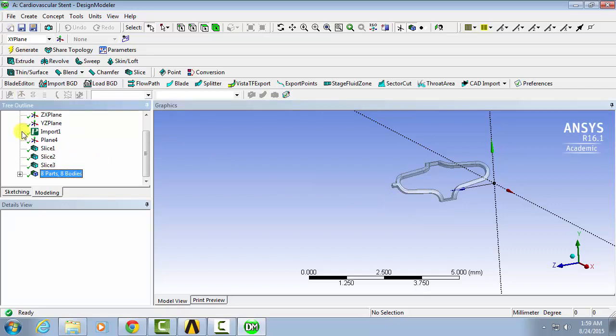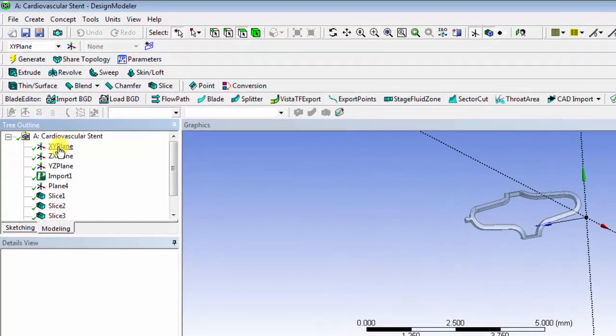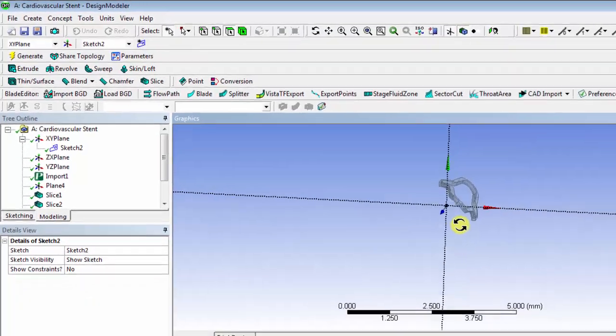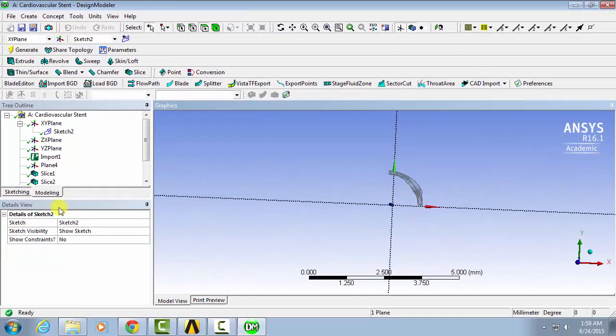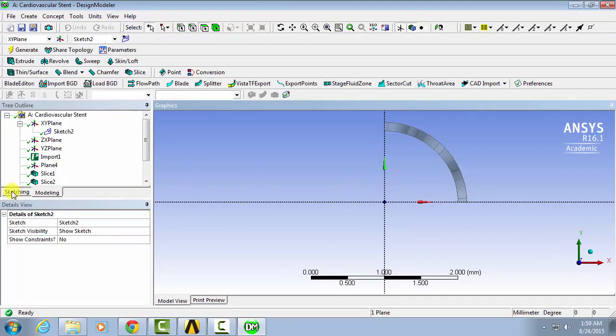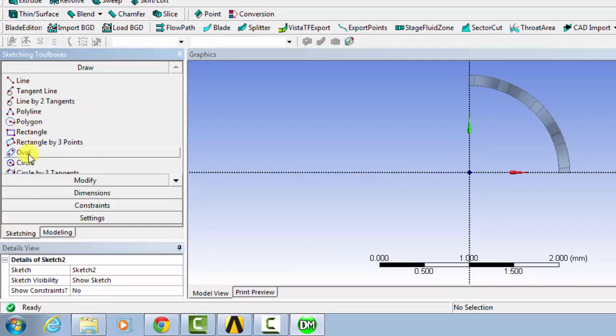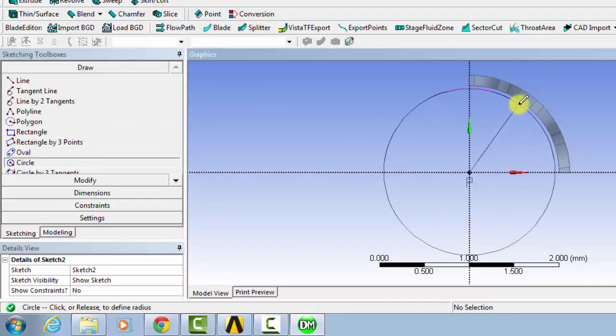Now we have to create the geometry for the balloon that goes inside the stent. To do that, we'll click on XY plane and then create new sketch. So that'll create a sketch that's facing this way. You can press on the positive Z to zoom in. We'll go to sketching, and then we'll create a circle under the draw. That's starting at the origin and up to there.